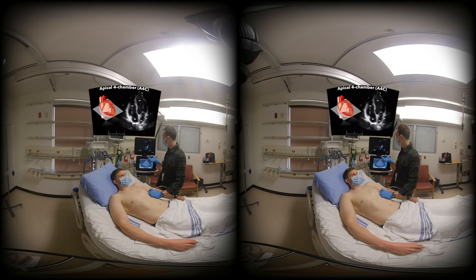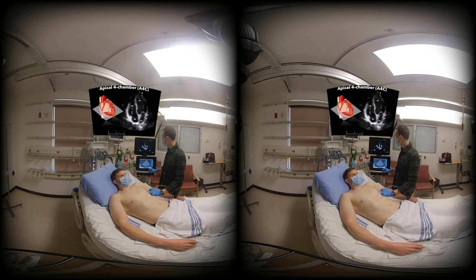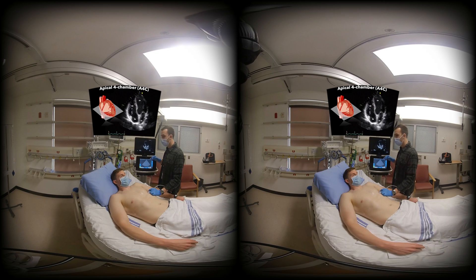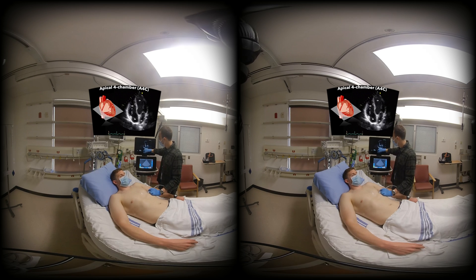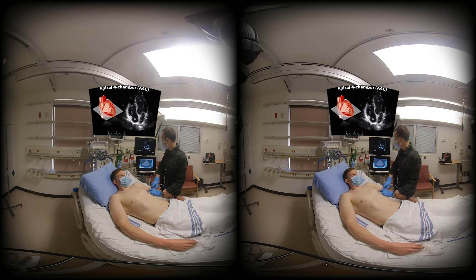If I wanted to get a better look at the right ventricle, I could rotate my transducer on the patient's chest so that the beam was coming towards the right ventricle from that side. Moving my probe a little bit laterally allows me to better insonate the right ventricle and see its movement more clearly. Right ventricular function is more nuanced to assess than left ventricular function — there's both a longitudinal motion towards and away from the apex, and a concentric contractile motion. The longitudinal motion can be assessed by looking at the tricuspid valve annulus and how well it moves up and down. The concentric contraction of the RV is assessed by looking at the RV free wall and seeing how well it moves inwards during systole. This view is a little foreshortened, but you can see clearly that the RV is functioning well in both longitudinal and concentric contractility.